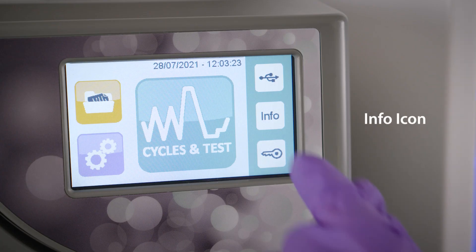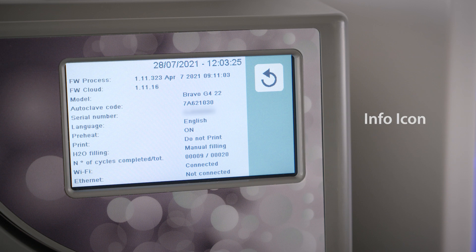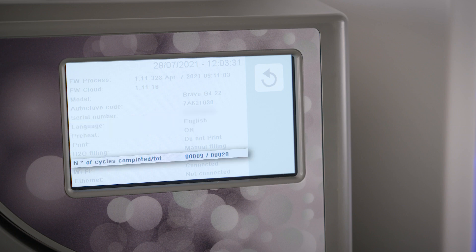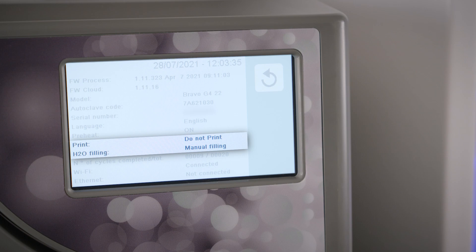The Info icon provides detailed information about your unit, such as the current firmware version, serial number, language, cycle count, connectivity status, and devices connected to the unit.